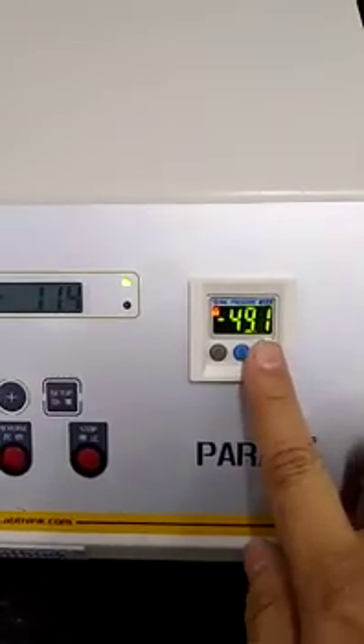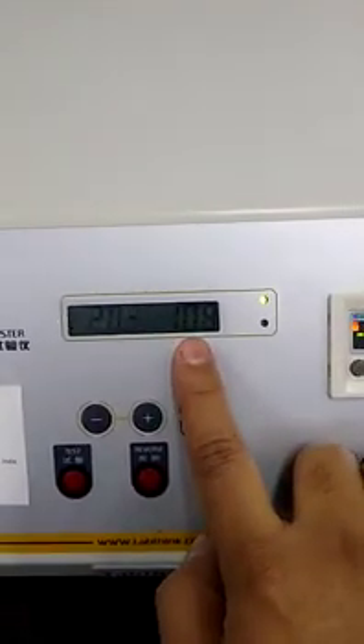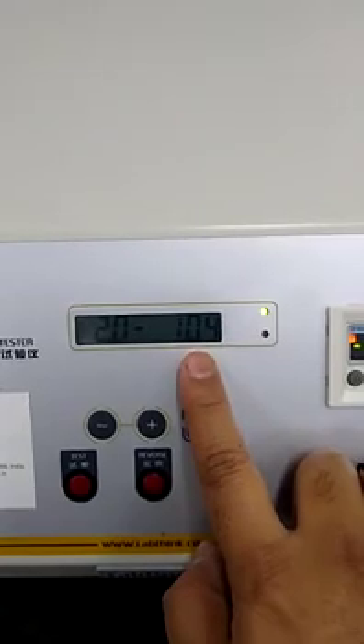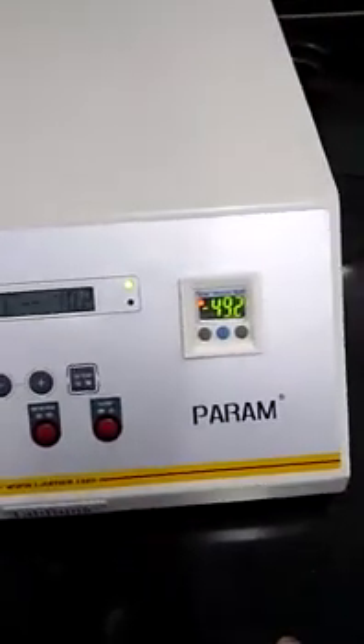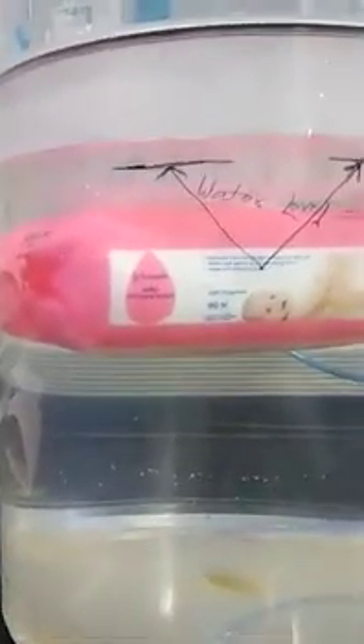It has reached minus 50 kPa and now the countdown of the hold time will start. 107 seconds are left. There is no leakage inside it at 50 kPa.